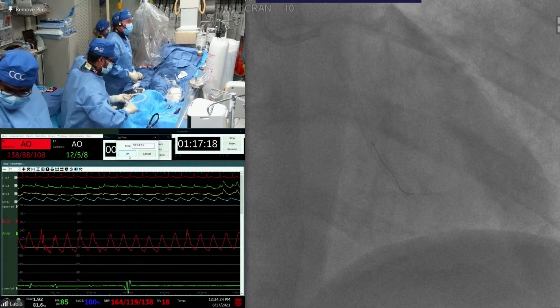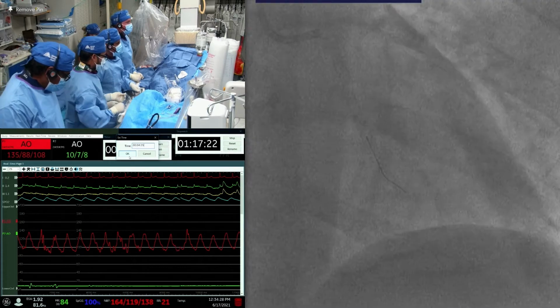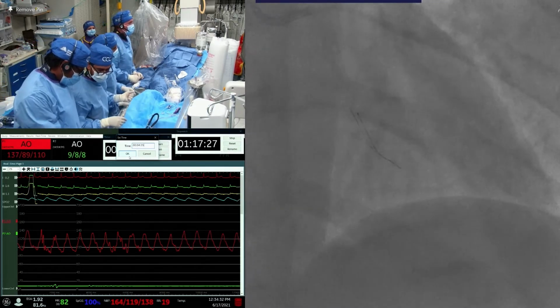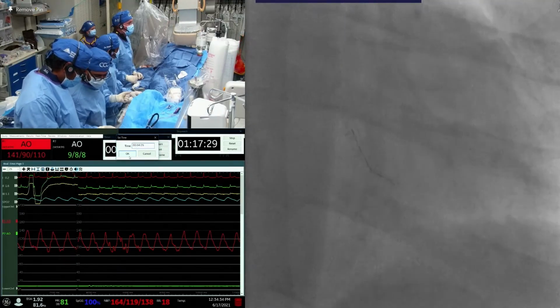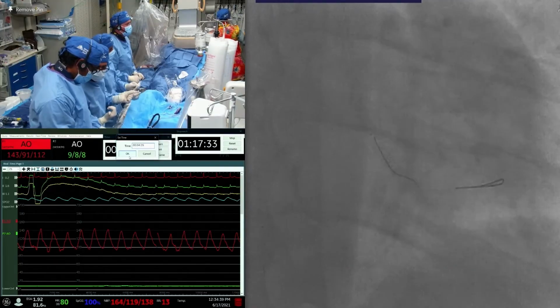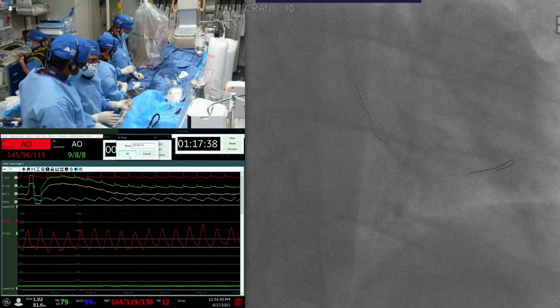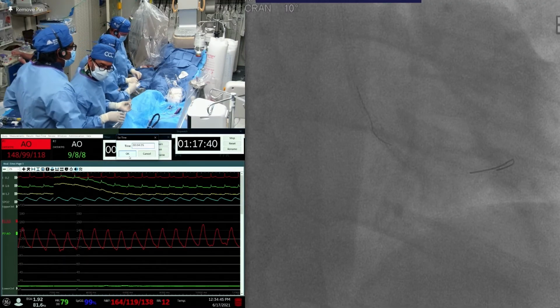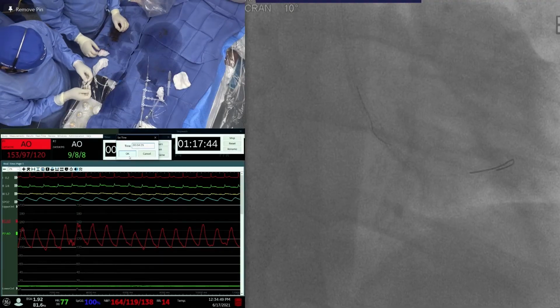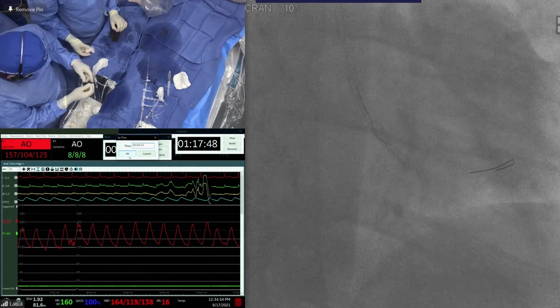No, we think that one layer of ISR is enough. Brachytherapy is still going to save you another stent and probably will get you the best result. So I think that for all those cases that you showed today, even the underexpanded one, it's probably better to put brachytherapy instead of another stent. The other comment that I had, if you have two layers of stent, this is going to be much more difficult to open an underexpanded stent. But brachytherapy to me, for DES restenosis, is the first line.